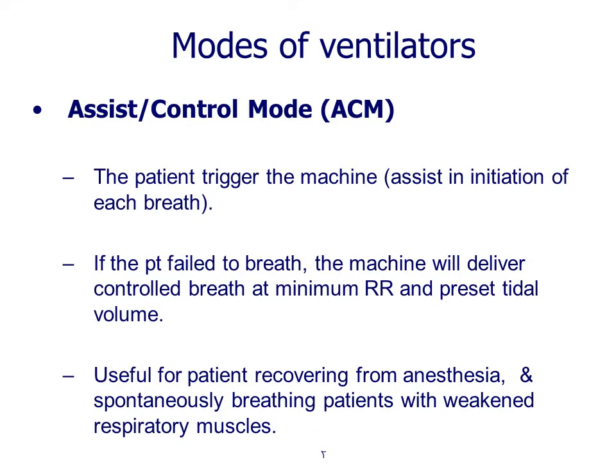Assist controlled mode, ACM. The patient triggers the machine, assisting in initiation of each breath. If the patient fails to breathe, the machine will deliver a controlled breath at minimum respiratory rate and preset tidal volume. إذن المريض يساعد الفنتليتر بعملية initiation of the breath، وإذا المريض فشل في أخذ هذا النفس the machine will deliver a controlled breath، سوف يعطي نفس كامل وعدد من التنفس و preset tidal volume.